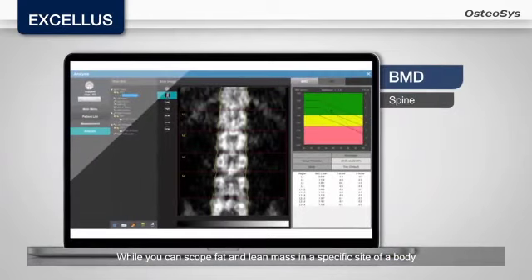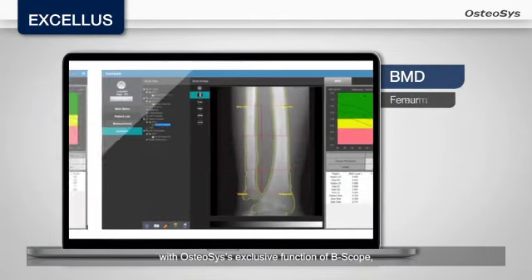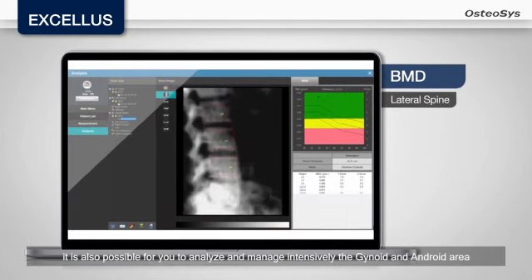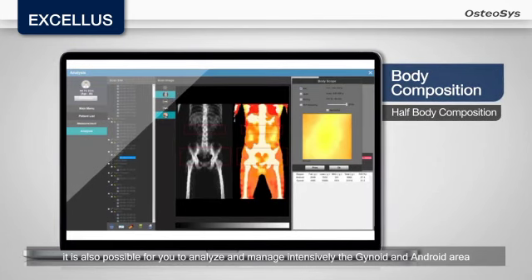While you can scope fat and lean mass in a specific site of the body with the osteosis-exclusive B-scope function, it is also possible to analyze and manage intensively the gynoid and android area.